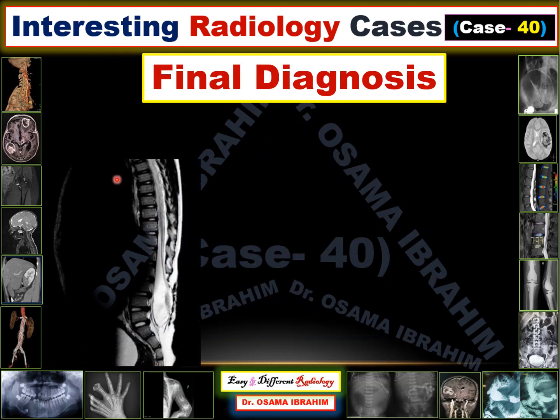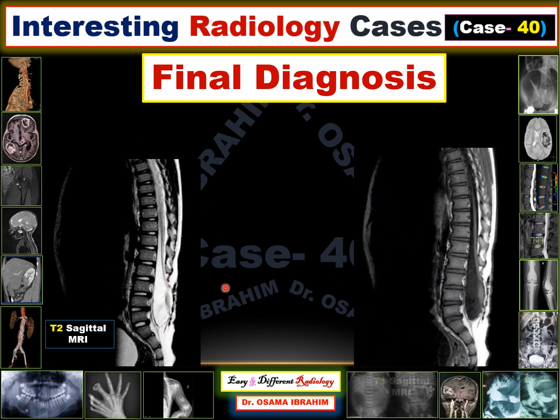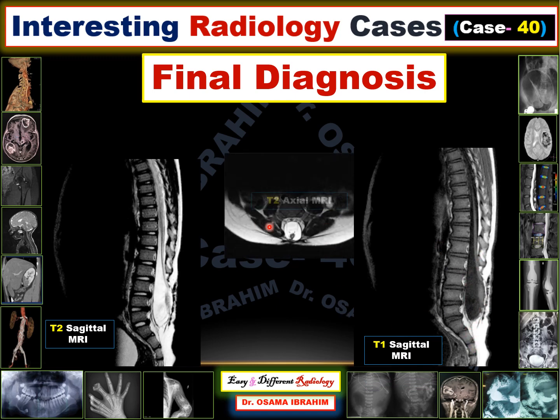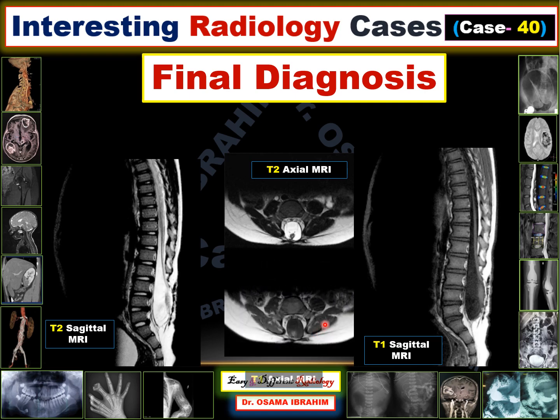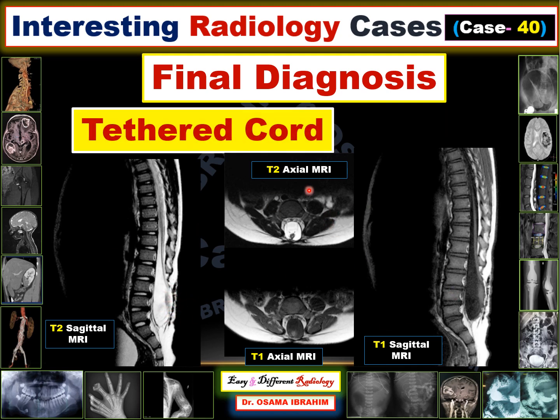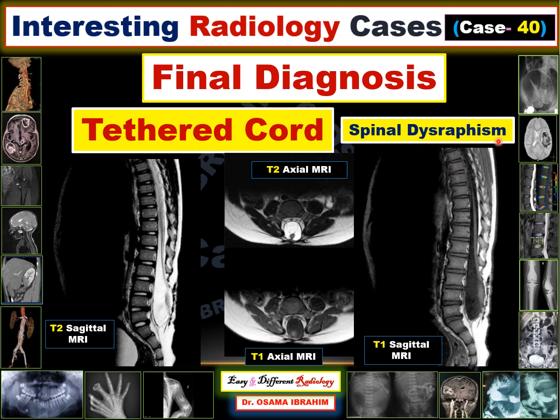The final diagnosis for this case: sagittal T2-weighted imaging and sagittal T1-weighted imaging with CSF appearing dark, along with axial T2 and axial T1, show an abnormal location of the cord with a thickened filum terminale. This abnormality is called tethered cord. Tethered cord is part of spinal dysraphism. It can be associated with other anomalies or it can be diagnosed alone, as in this case. The final diagnosis is tethered cord.